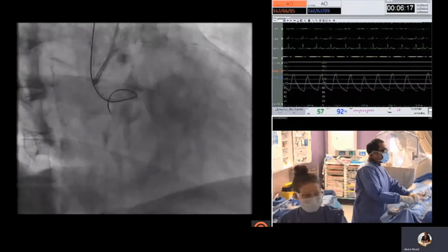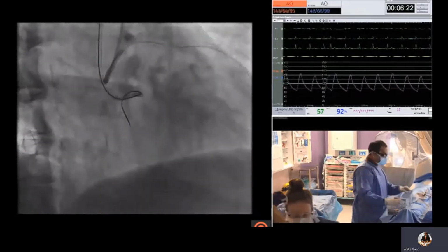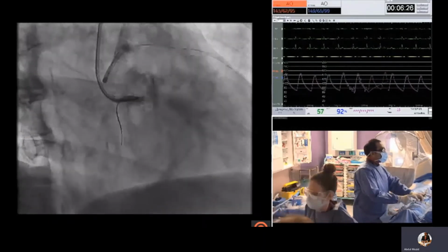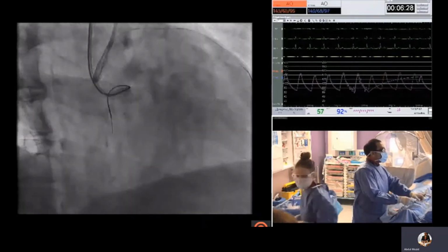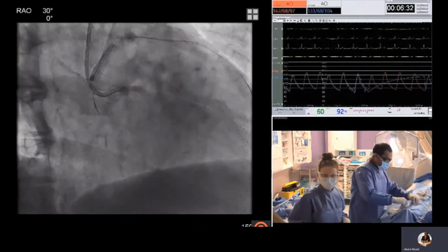After some drilling, they appear to have made some progress, and there it just seems to pop. The test shot here shows that this is probably outside the line of the vessel. So this is withdrawn.